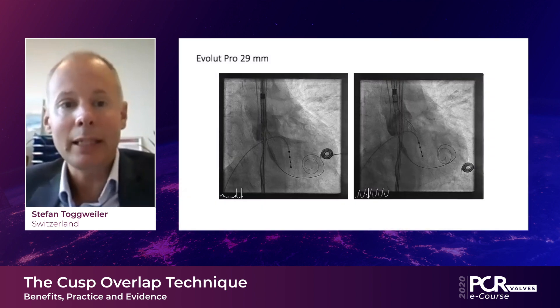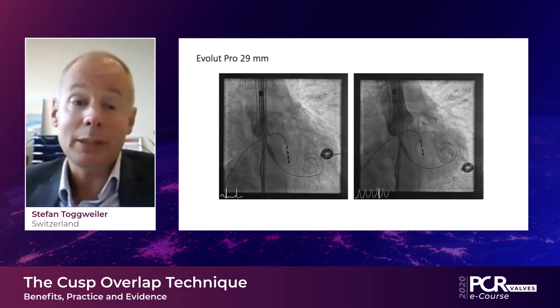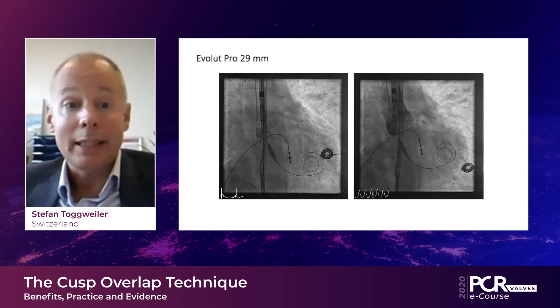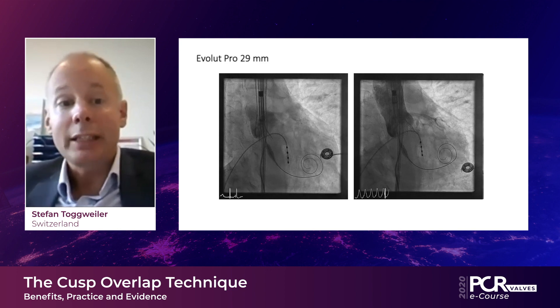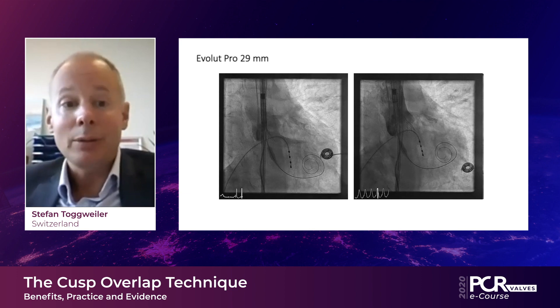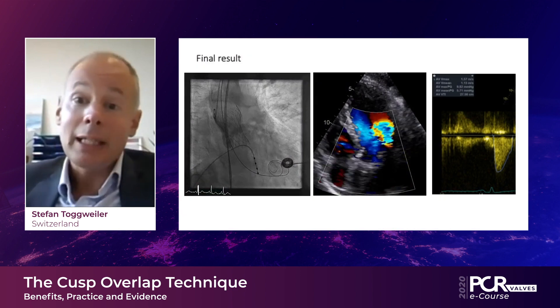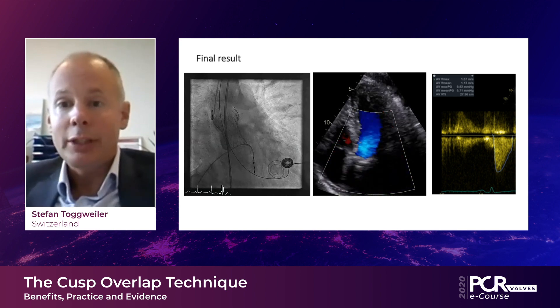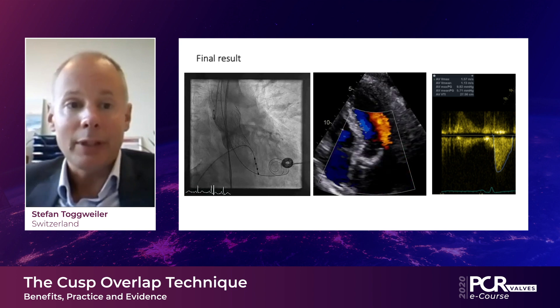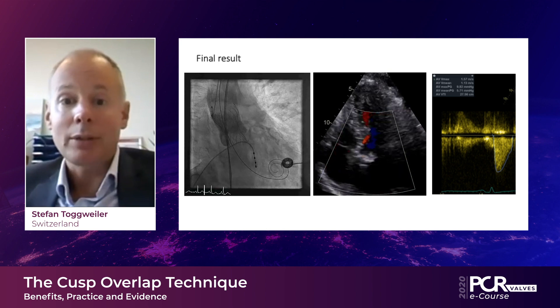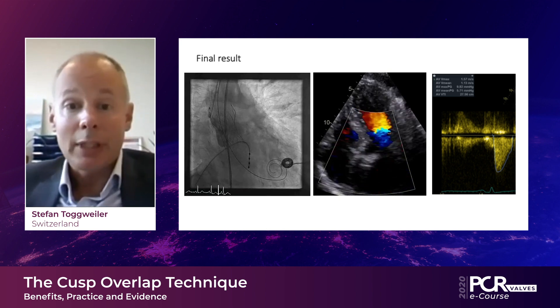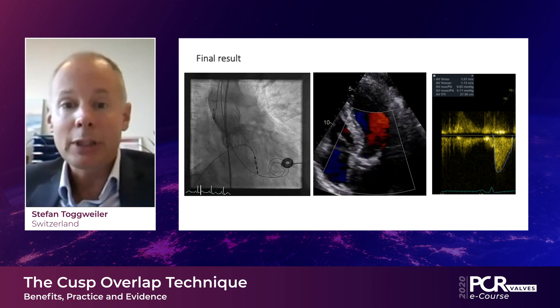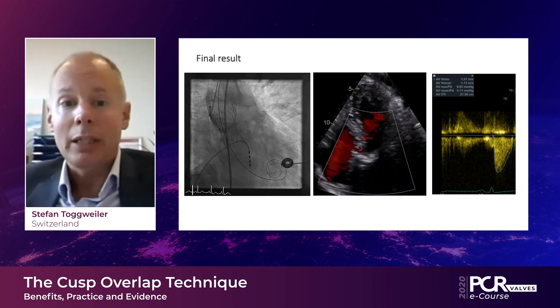You can see on the next slide the next step, slowly opening up the valve. It really stays very stable here. If you pay attention to the marker band on the catheter, you can also see that it's a nice line indicating that the projection of the valve and the annulus are overlapping and are the same. The last part we like to do with full rapid pacing at 180 to ensure stability, then we fully release the valve. You can see the final result here on fluoroscopy and also on echocardiography. In this patient, there was absolutely no perivalvular leak and the mean gradient was six millimeters of mercury.